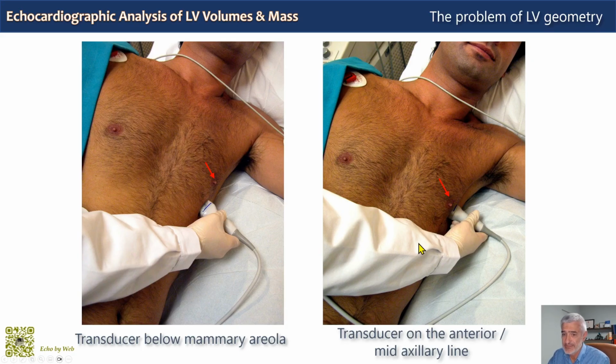As I mentioned, it is essential to manage breathing while you try different positions of the transducer until the correct view is obtained. This is very important. It's much more important than seeing the endocardium well.